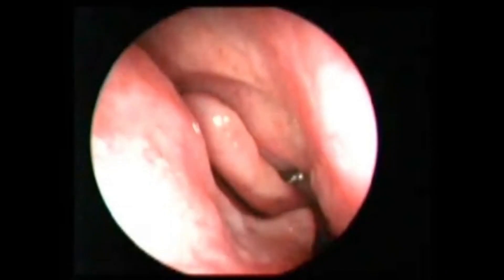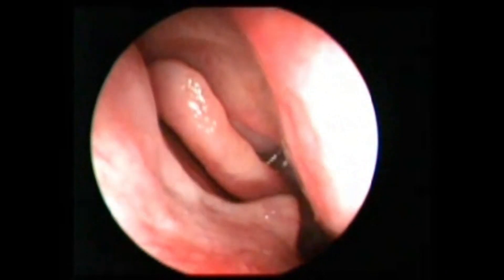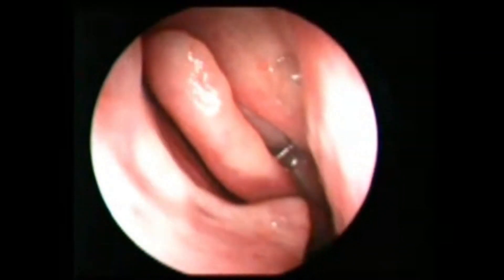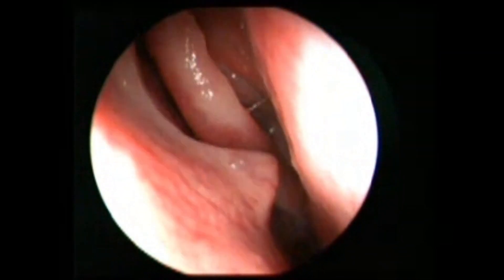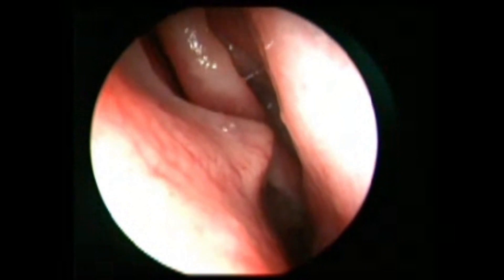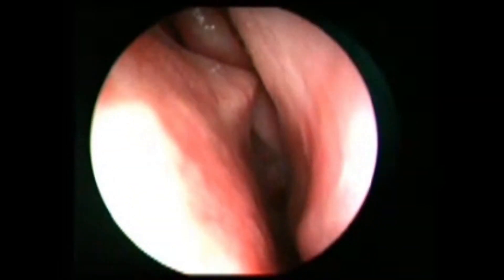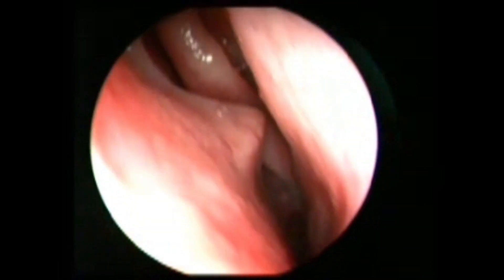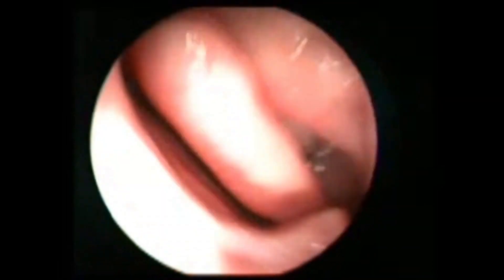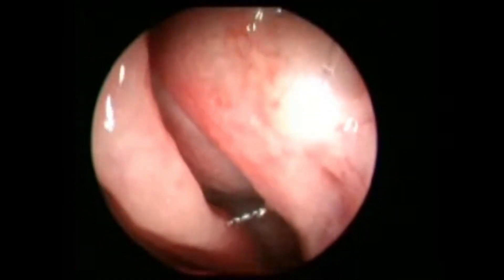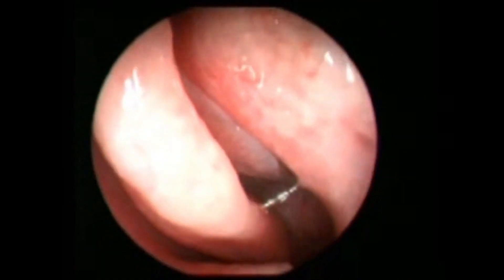We have a case of a septal spur, and usually they come with nasal bleed or sometimes Sluder's neuralgia — that is headache — when it is touching onto the lateral wall. But here you can see it is not impinging onto the lateral wall; it is just away but it is touching the middle turbinate.